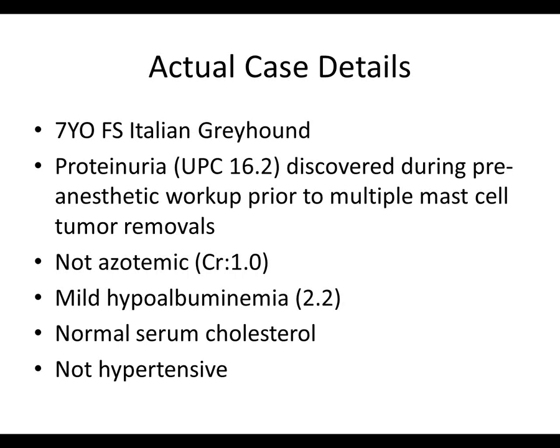Again, not very common on our service, but the histopathology and the electron microscopy and the immunofluorescence are classic, and that's why I wanted to show it to everybody. Okay? Any questions about mesangial proliferative disease? Anyone?